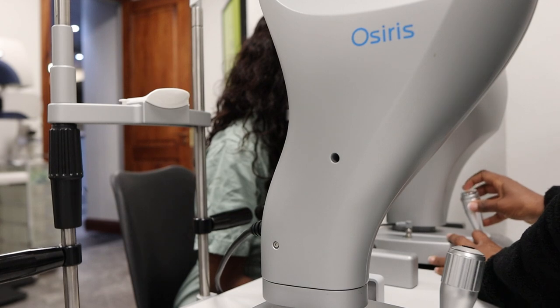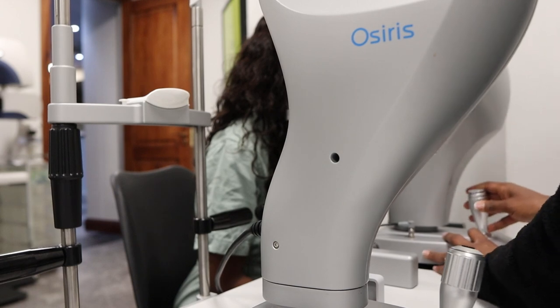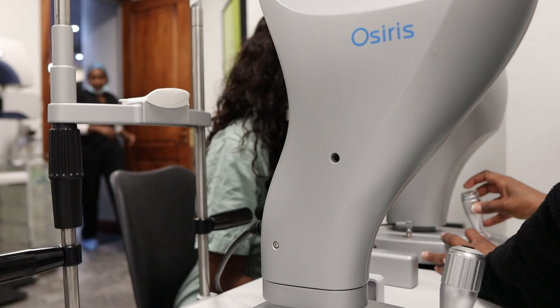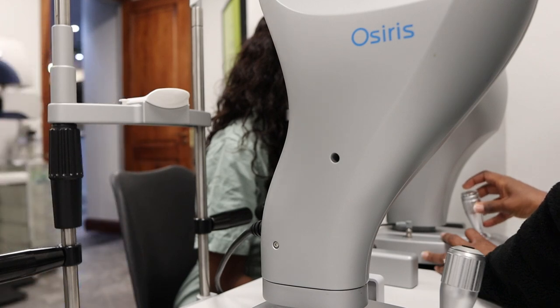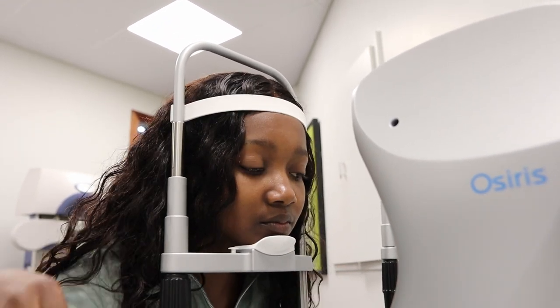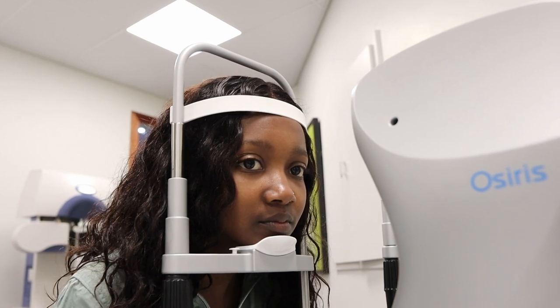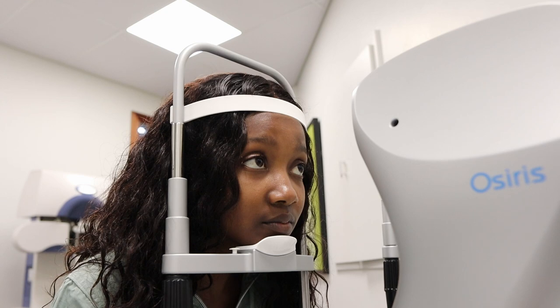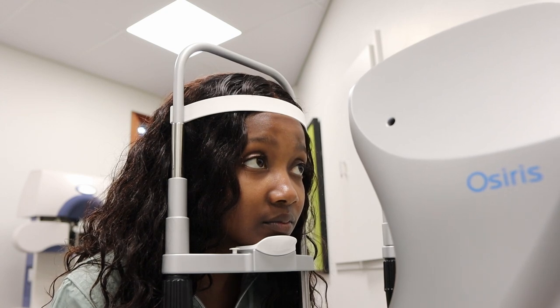Still on your left eye. Please blink twice. Keep your eyes open, please. Perfect. I'm just going to repeat this one. Please blink twice again. Now keep your eyes open. Perfect. Moving to your right eye. On this one, I'm going to scan your corneas to get your refractive power. Cool.